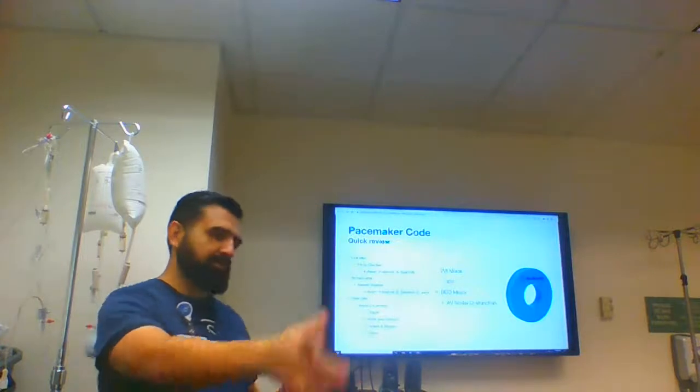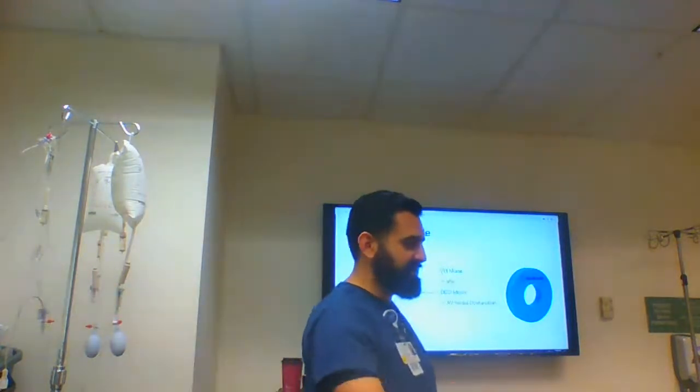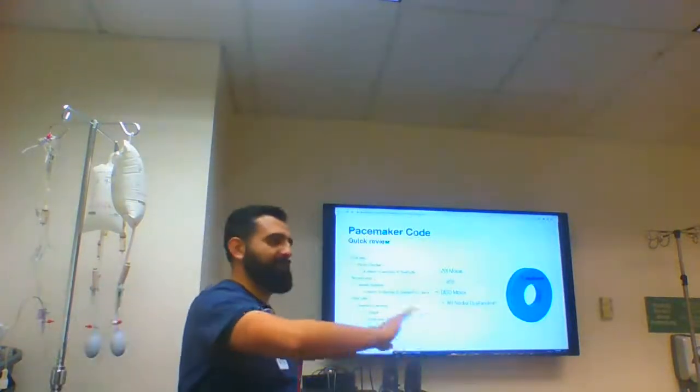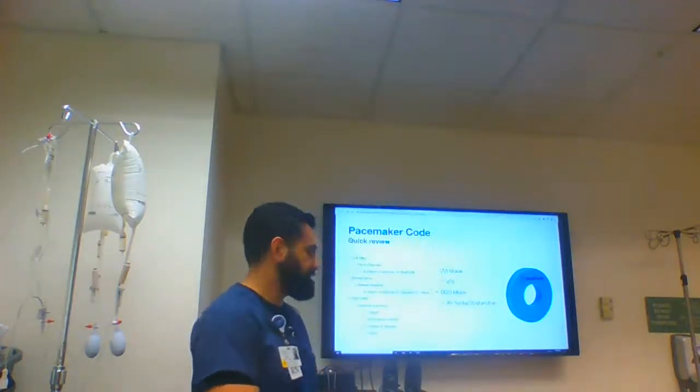So for transcutaneous pacing, you're gonna have to crank it up way higher, and the patient is not gonna like it because they're gonna feel it. So that's separate, for sedating and so on. But just know that.